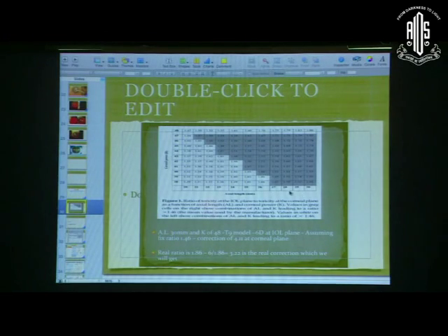But in the extremes of the cases, as you can see in this table, as the axial length increases, 29, 30 or 28 in high myopes, or if the corneal diopter increases, this ratio becomes 1.7 to 1.8. So it's not 1.4, it's 1.8. So let's take an example. If we need 6 diopter at the IOL plane, if we assume the fixed ratio of the company, its correction is 4.1. But the real ratio at an axial length of 30 and 48 diopter power is 1.8, which comes out to 3.2 only. So we are getting undercorrection.